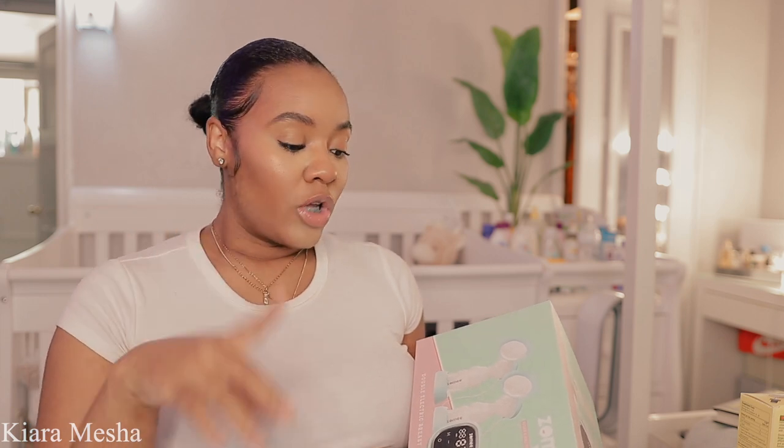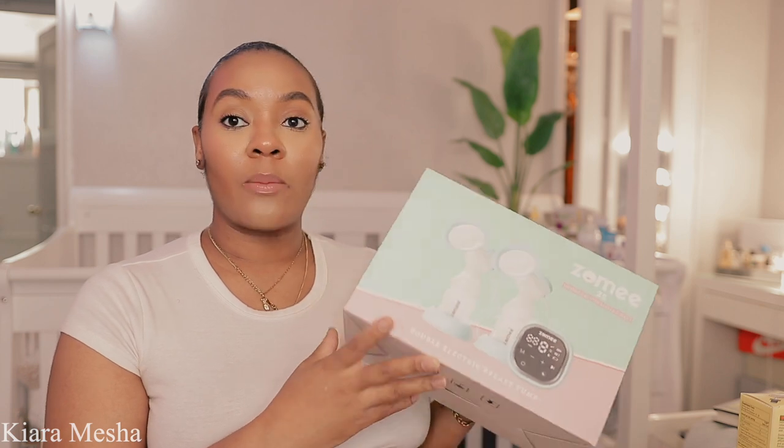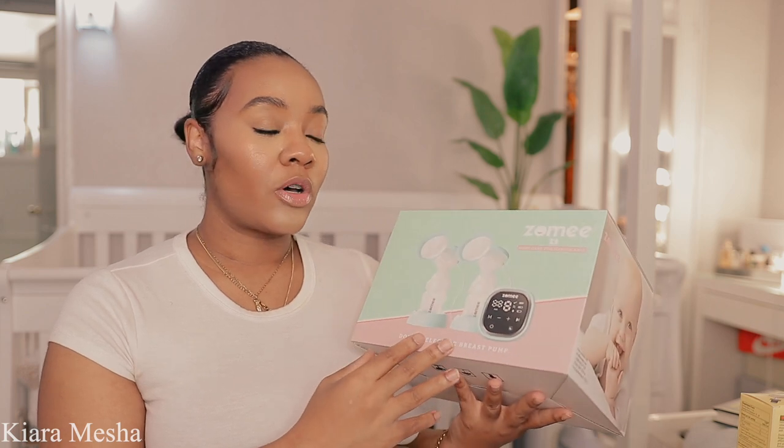I was on Aeroflow breast pumps and I saw this same exact pump on there. I did breastfeed with my first, Winter, but not for very long — I'm gonna do a whole video on why that didn't work out, but mainly it was stress and postpartum, so take care of yourselves. This is the breast pump I really opted for because I do work from home.